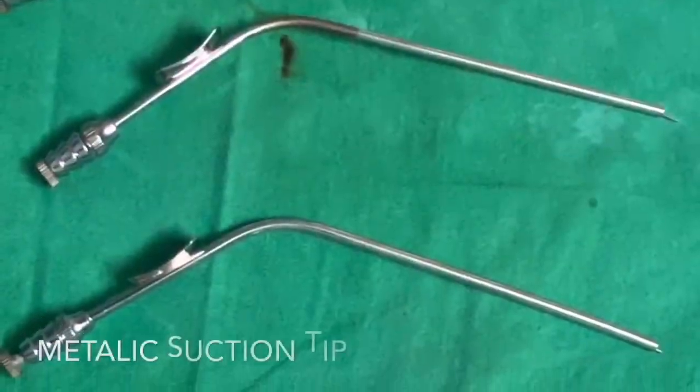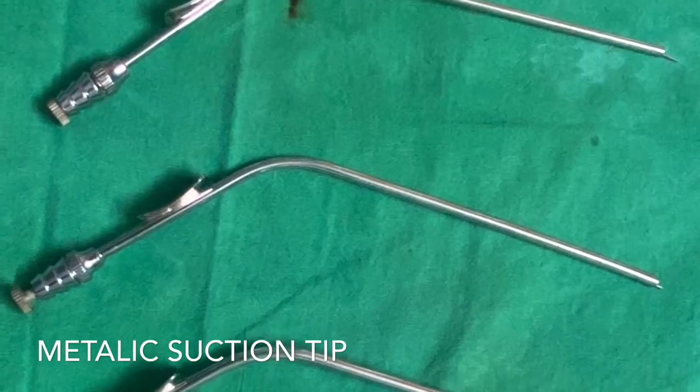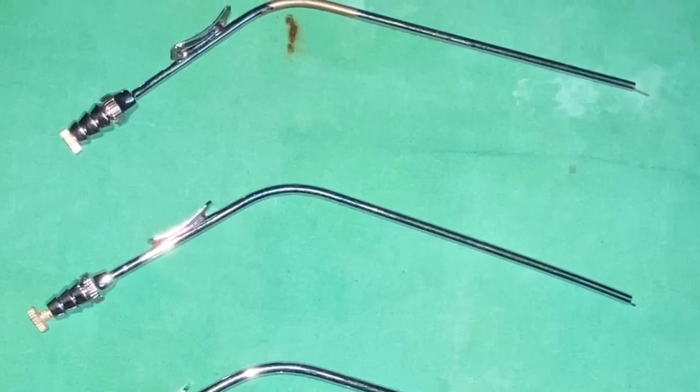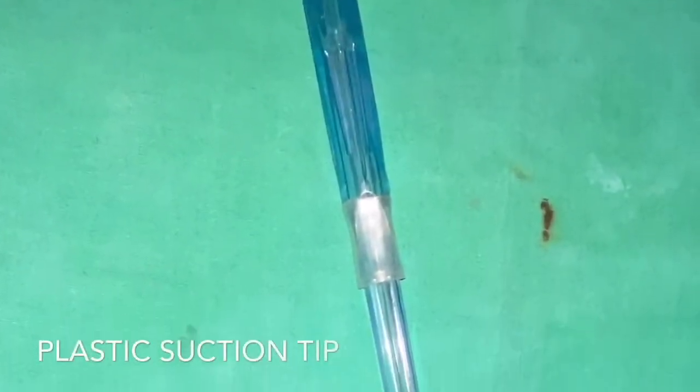These are different-sized metallic suction tips along with their stylets. These metallic suction tips are used for suctioning at the operation site. This is a plastic suction tip, usually used for abdominal surgeries.